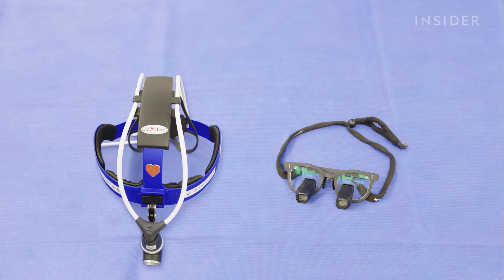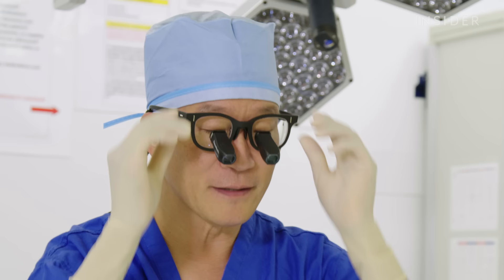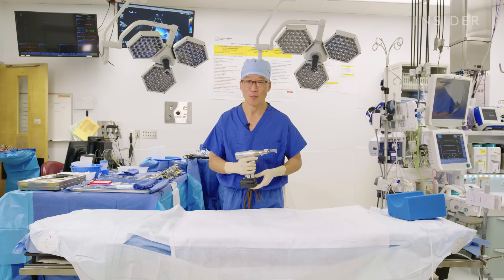For every operation, we start with these accessories, and the first are the surgical loops or telescopes. These are a three and a half times magnification, and these allow us to see very small pieces of anatomy in a very clear manner. In addition, this is the surgical headlamp, which gives us a very bright field of view so we can see every nuance of the anatomy.